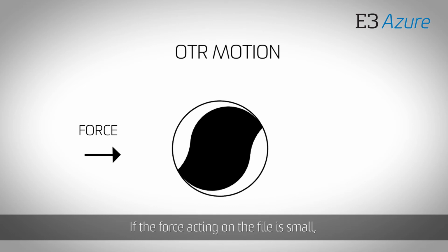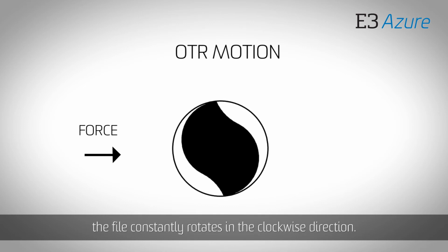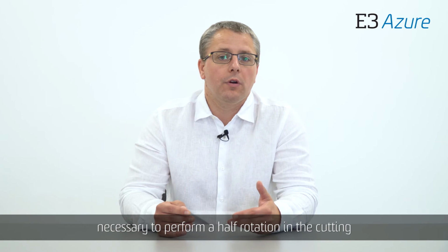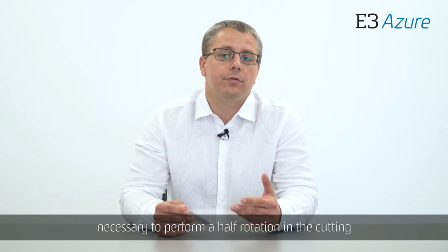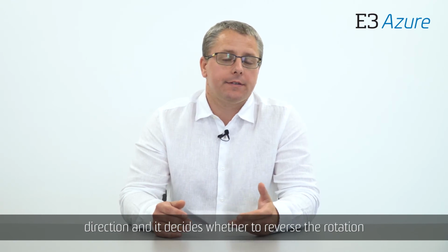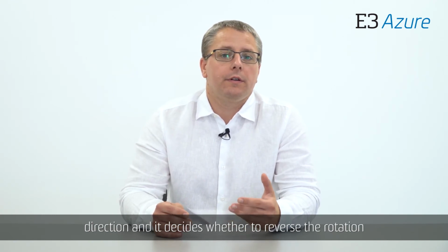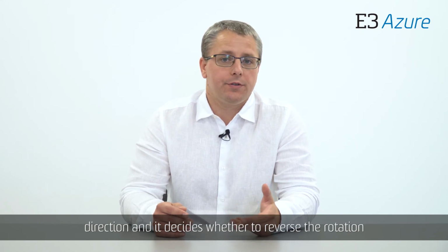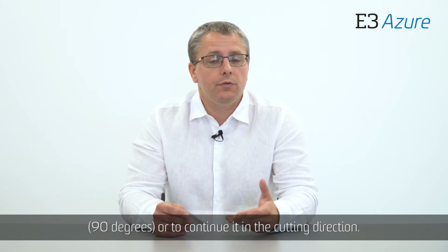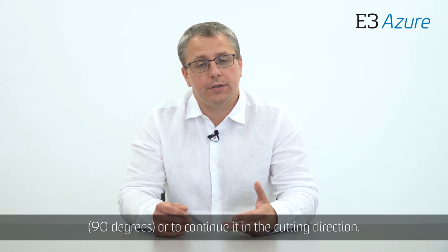If the force acting on the file is small, the file constantly rotates in the clockwise direction. So the endodontic motor calculates the force which is necessary to perform a half rotation in the cutting direction, and it decides whether to reverse rotation 90 degrees or continue it in a cutting direction.